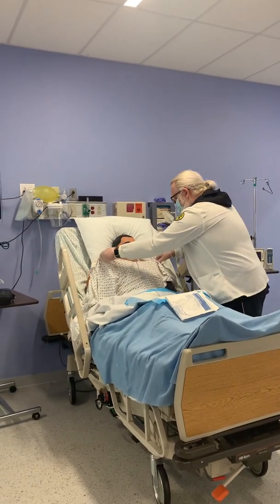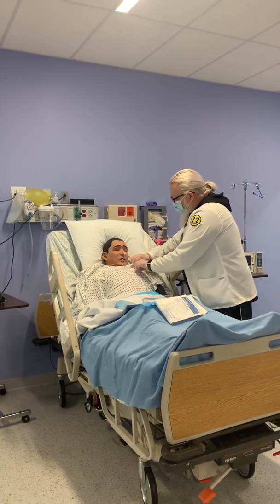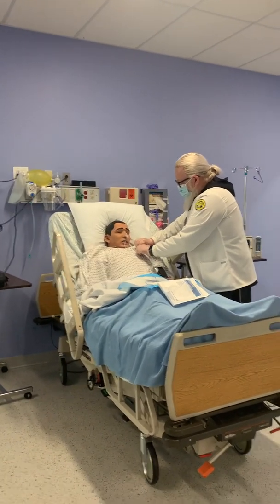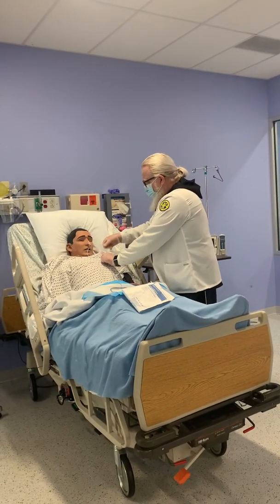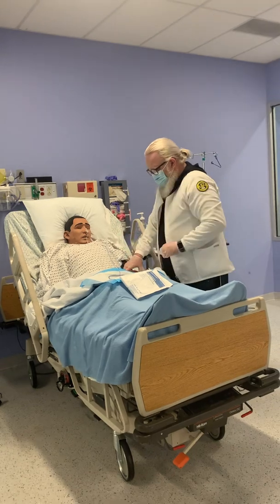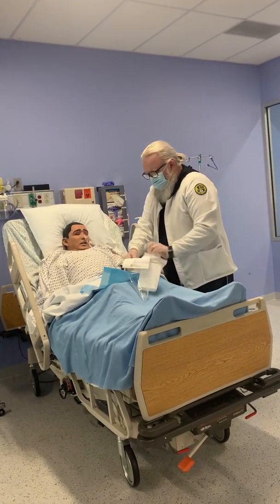So I'm gonna bring up your gown. I'm going to make sure that I adhere the tube to your gown. Make sure that when you are changing your gown or anything, you don't tug on this. You don't want this to come out again, okay? I'm gonna clean up the area, tolerated it very well. Sorry if it did hurt a little bit.